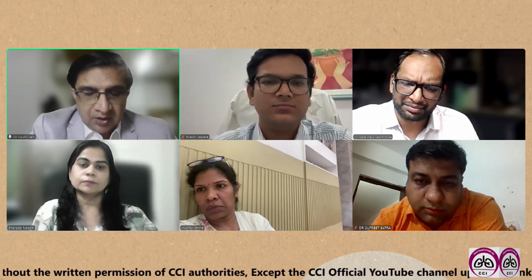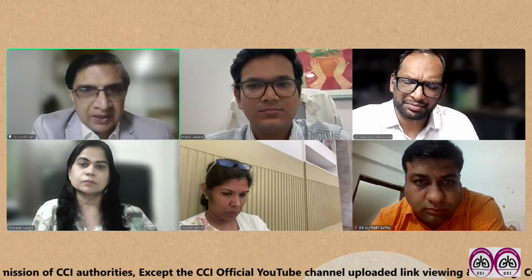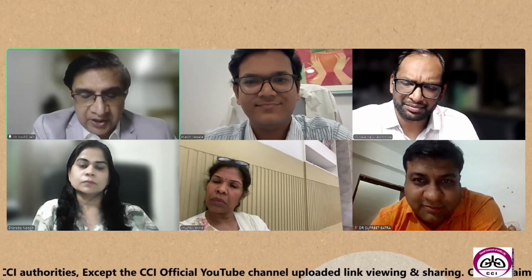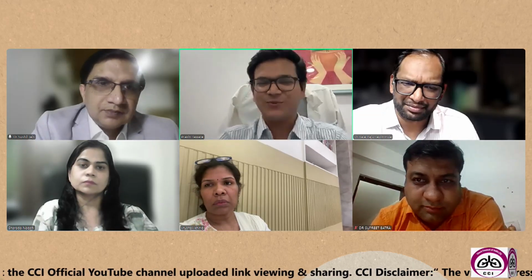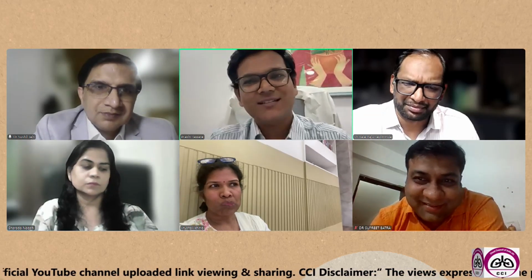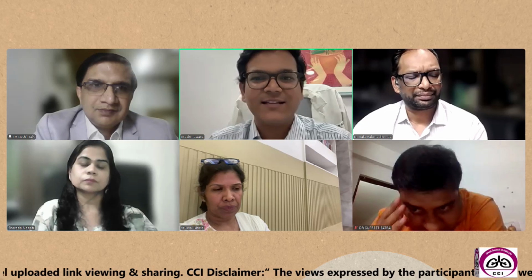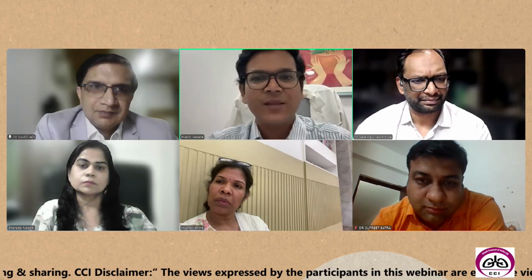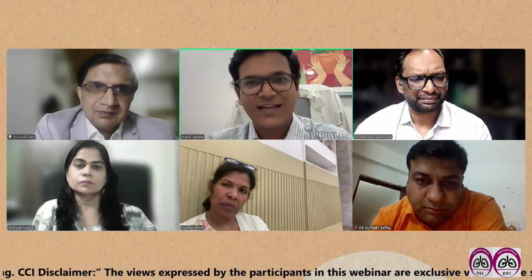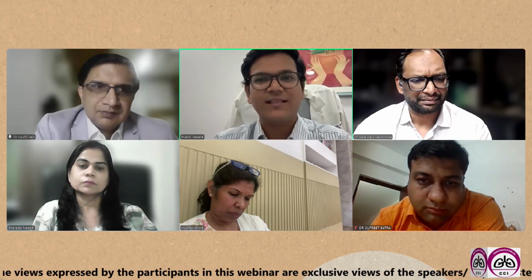Thank you. My next question is to Dr. Pravin. Dr. Pravin, if the patient starts coughing intensely while the needle is inside, again, a very practical question for you. When the needle is inside the lymph node and the patient starts coughing intensely, how do you manage the situation? Yes, this is very common, sir. If the patient is under a light sedation and the patient is coughing very intensely, then remove the needle immediately, or you can withdraw the needle inside the sheath, so that needle-related injuries can be avoided. And then deepen the sedation. Ask the anesthesiologist to deepen the sedation and then proceed.